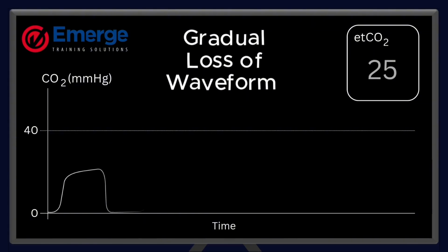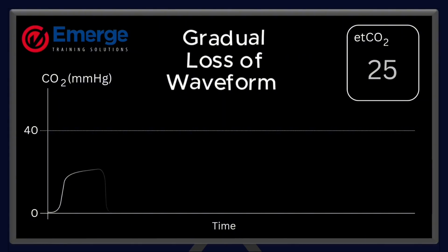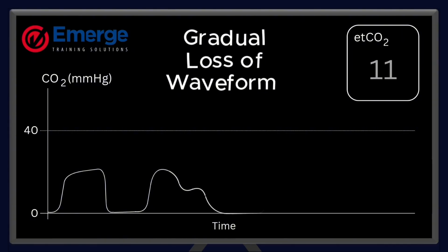So in the first seconds, your job is simple. Check the circuit before you check the patient. Look for a loose mask strap, a kinked nasal cannula, a deflated cuff, or perhaps a displaced supraglottic airway. Then widen your lens. Is the patient tiring? Are tidal volumes diminishing? Are their chest movements slowing? A gradual fade is a warning. Something is slipping, either the equipment or the patient, and if you catch it now, you prevent the slide into complete respiratory failure.